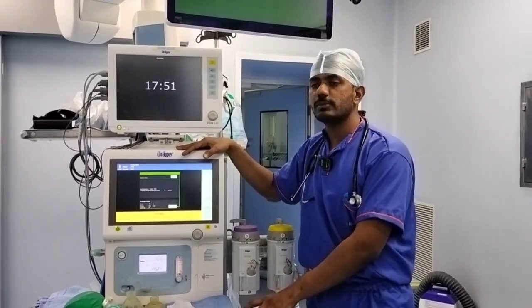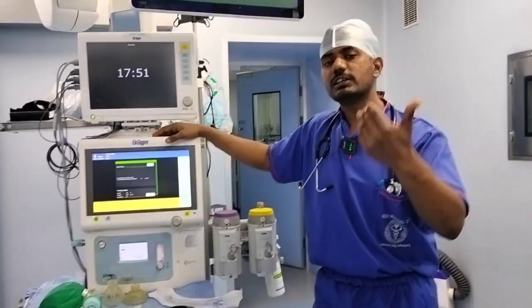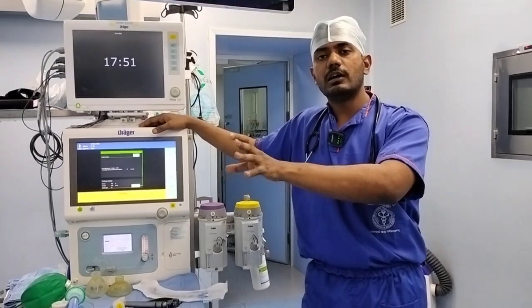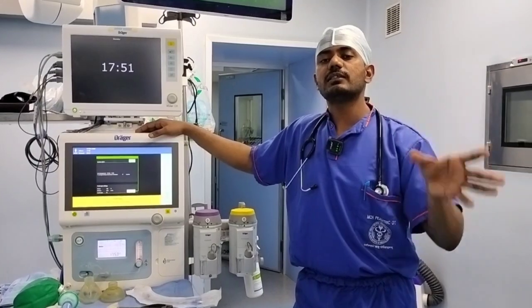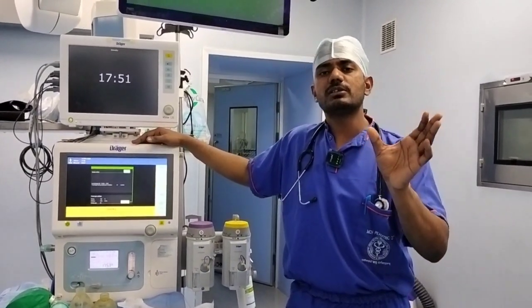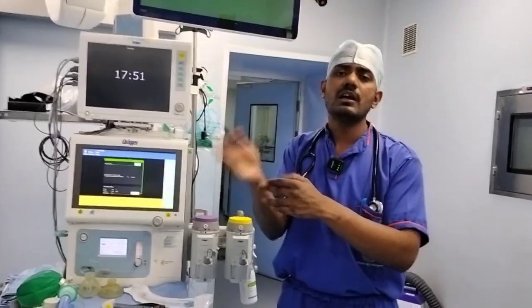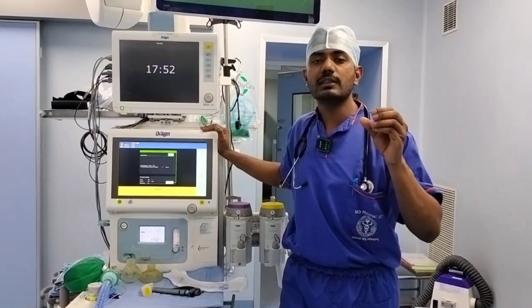For example, in anesthesia also, sometimes at the end of surgery we don't extubate the patient. We keep the patient intubated on the ventilator and send them to the ICU, but usually those patients get extubated fast. But if the lung is very badly damaged, then it depends on that. In general, we can understand that when a patient is on a ventilator, his lungs are not working properly and he is in a critical condition, and the rest has to be discussed with the doctor. I hope I have explained what a ventilator is in a simple way.